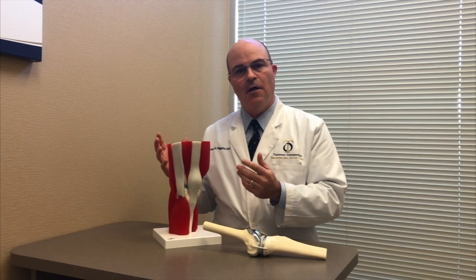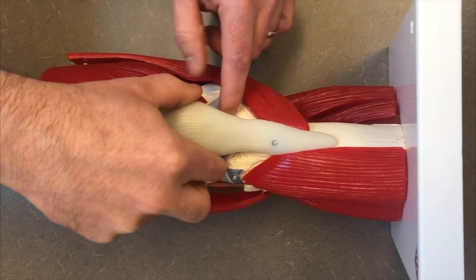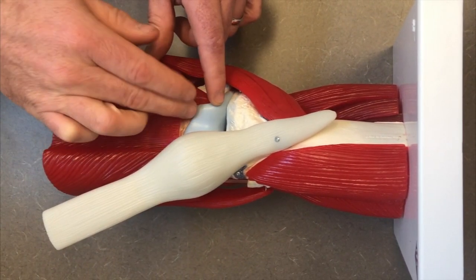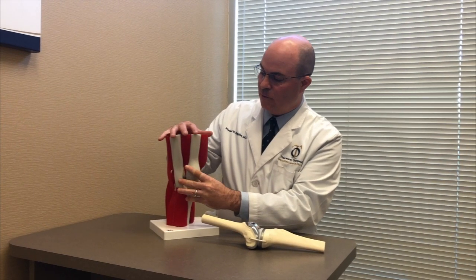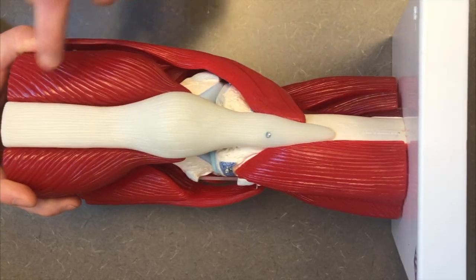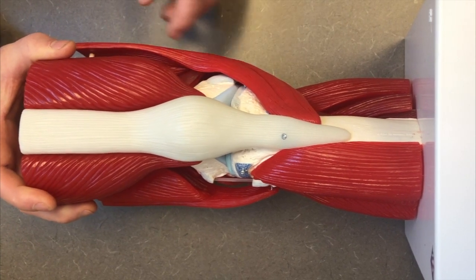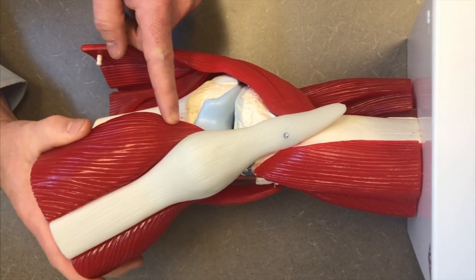With the traditional knee replacement, your surgeon will make an incision along the medial side of the knee capsule and then carry that incision up through the quadricep muscle and quadricep tendon, splitting the quad muscle and giving exposure to the knee. The way I do the procedure is through a subvastus approach. It's the same skin incision and the capsule of the knee is opened up, but I go below the vastus medialis. So I'm not cutting the muscle, I'm going below it, and that muscle is lifted off of the end of the femur, exposing the knee.